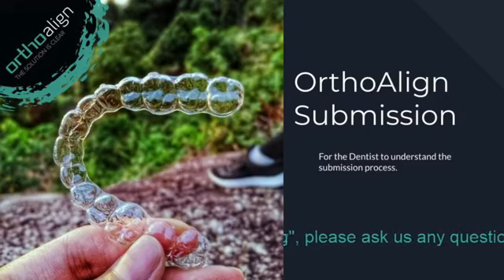On the right we can see the pictures here. We have an example of a lips closed picture, a smiling picture, and an occlusal cant. Then we have a right profile, left profile, and a 45-degree angle profile, left and right, of the patient. This helps our orthodontist look at the patient's smile line and the patient's resting lip, for example, to see if they need to bring the teeth in more or bring the teeth out more. So it really depends. This is where our orthodontist can look at the external of the patient.